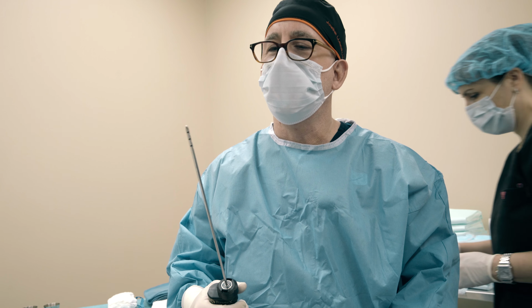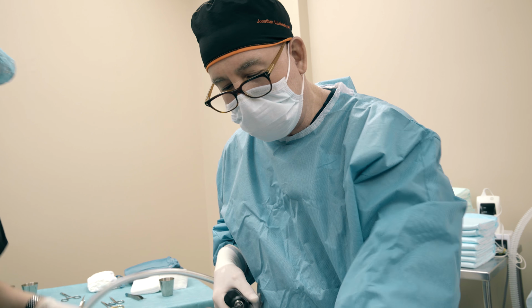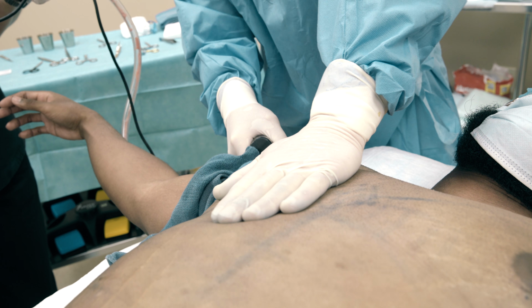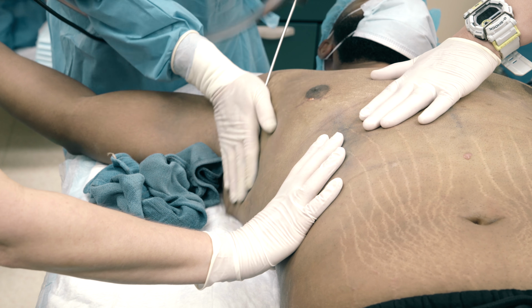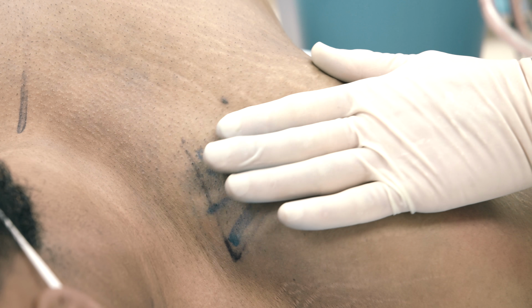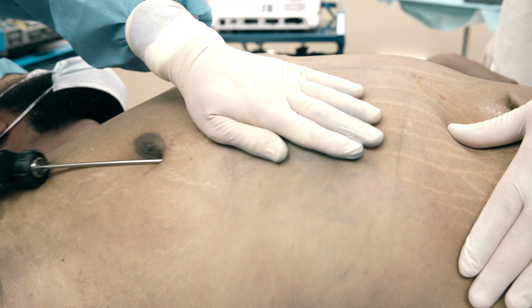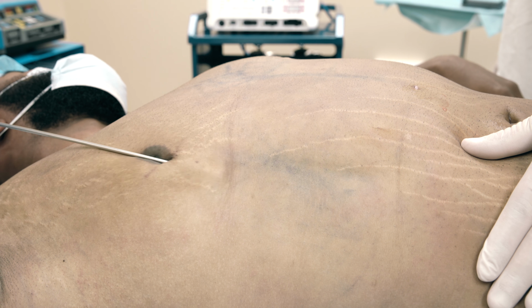Right, now we either stick in the eye with this, or we suck you out. Suck you out. So what I'm doing now, guys, I'm emptying the space. I mean, he's not a big guy, but I'm emptying the space, you know. See this nice semilunar line right here. I'm gonna sculpt the muscles a little bit, empty this a little bit more, but I want this nice space there.